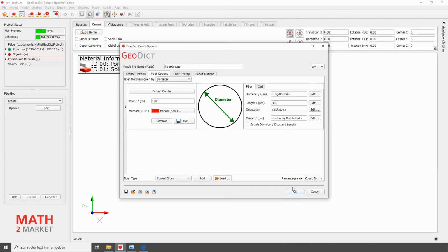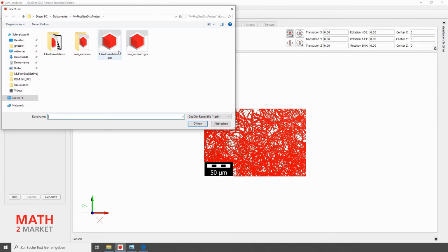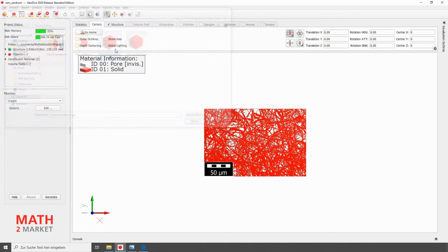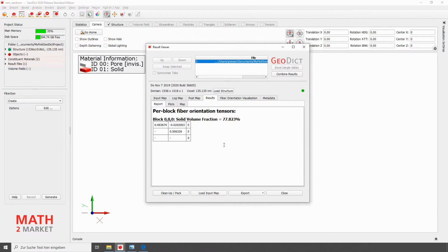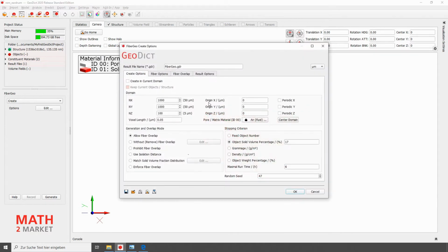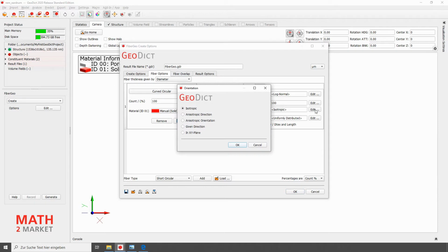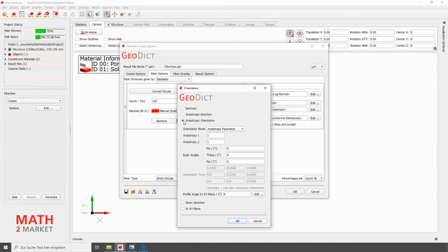To be able to use it, we close the edit window shortly via the OK button. This saves the entries we have made so far. Then open the fiber orientations GDR file that we created earlier. A GDR file is a GeoDict result. Here we can find the orientation tensor we want to enter into FiberGeo. To do this, we click on the Edit button again and go to the Fiber options. We click on the Edit button, select Anisotropic orientation, select Orientation Tensor, and enter the values from the GeoDict result file.